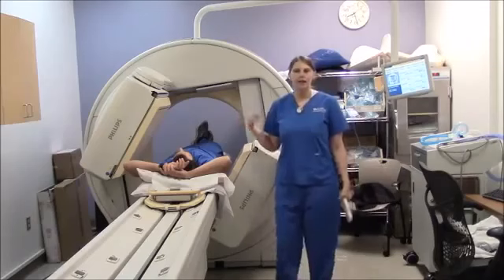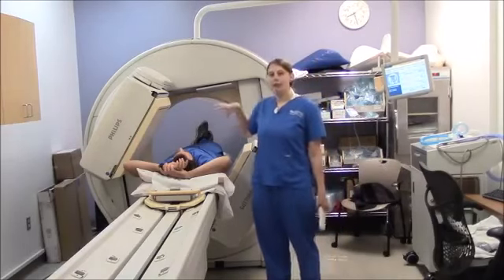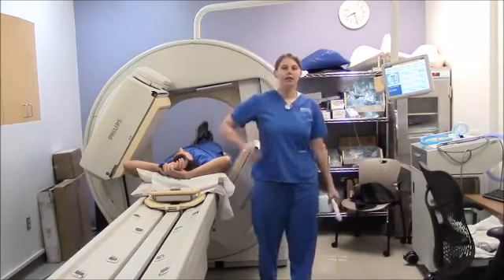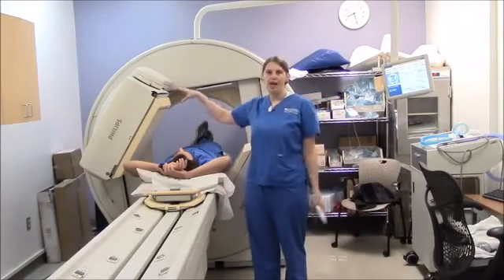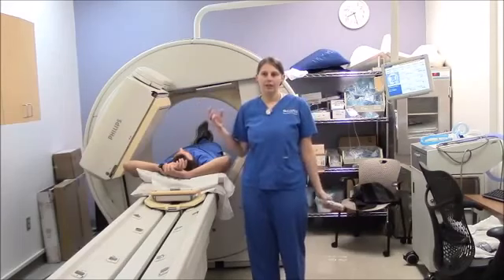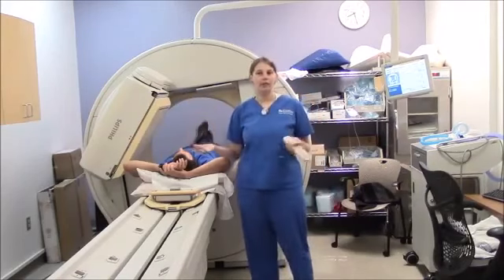And this would be our last view, taking an oblique picture of the front of one lung and of the back of the other lung that we missed. We would again bring the heads in close, take our image, move them out, and then we're done.